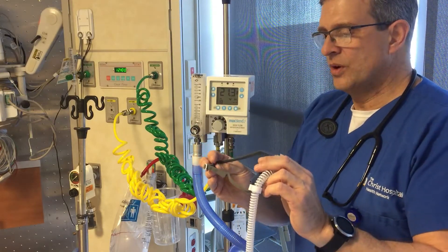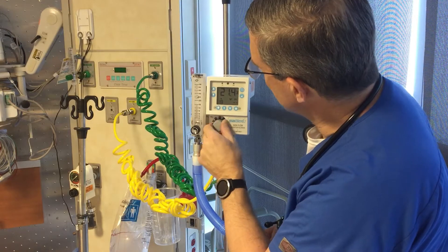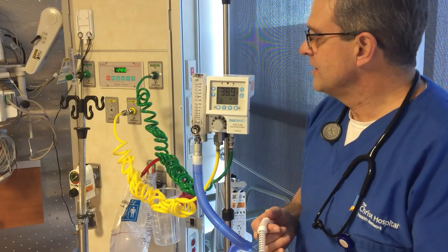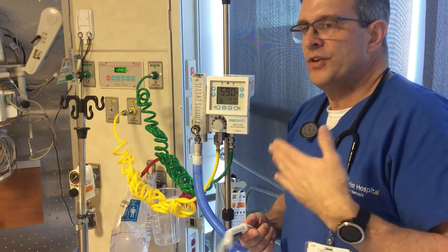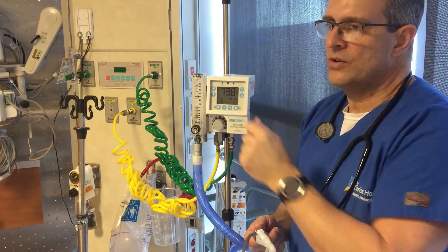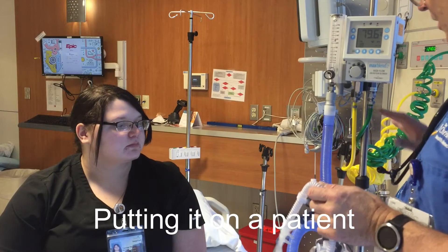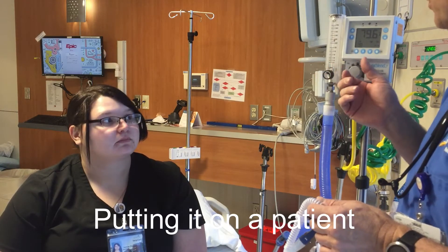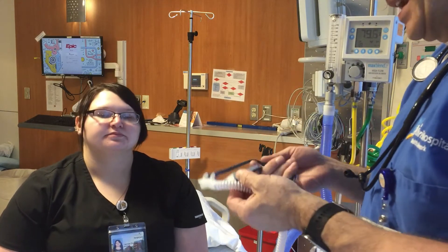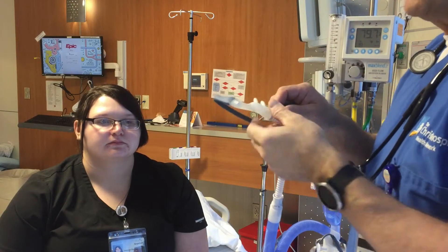This is really simple — we'll go ahead and fit this to our patient. If we need to set an FiO2, we just turn the dial here. I'll set it at 80% just to pick something. So now we have a flow and FiO2. If you need to increase the patient's oxygen level, you can increase the FiO2 or increase the flow, and then take it back down as they get better. We have our system set up, plugged in for gas and electric, with flow and FiO2 set.